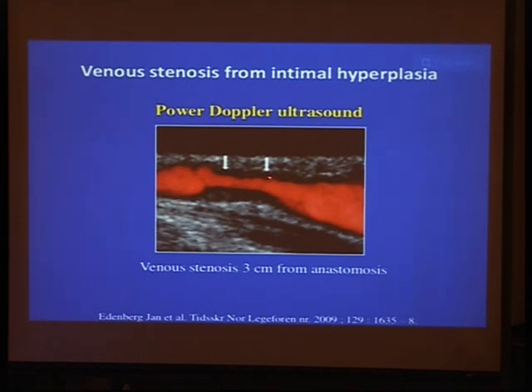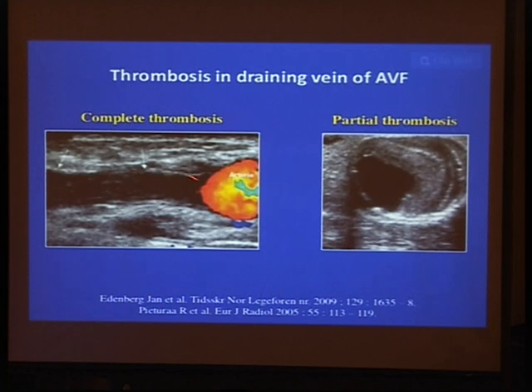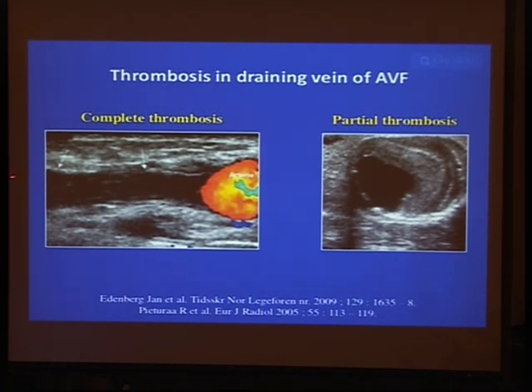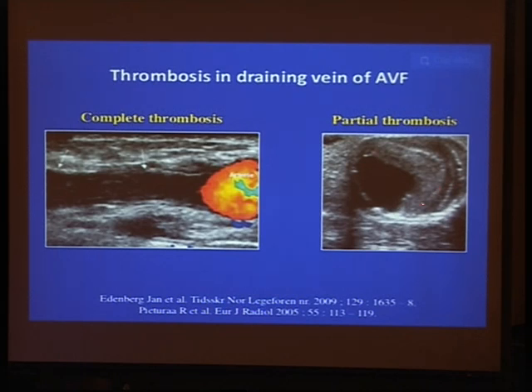On ultrasound evaluation of the fistula, we can see intimal thickening — this is a stenosis of the vein. This is an obstruction with no flow inside. Here we see flow inside the fistula but also a pellet of thrombus inside with no flow in that segment — this is a partially thrombosed fistula. In another case, we see normal blood flow here, and an area of organized thrombus occupying more than half of the fistula lumen with a small residual area of flow — this is a partially thrombosed fistula.